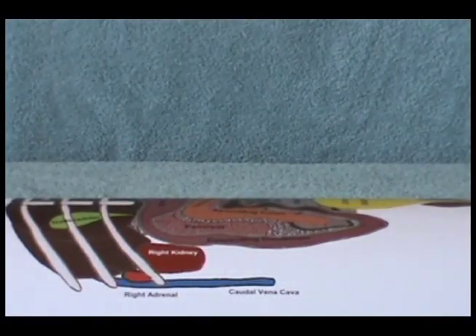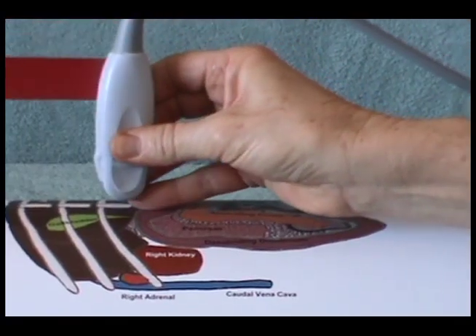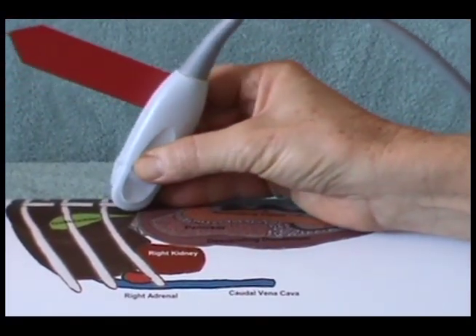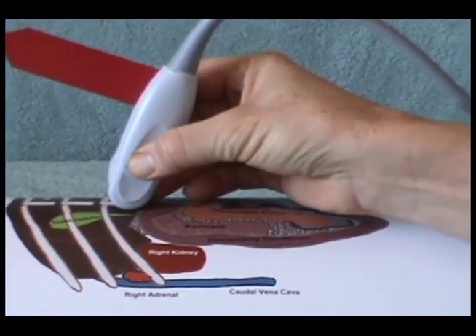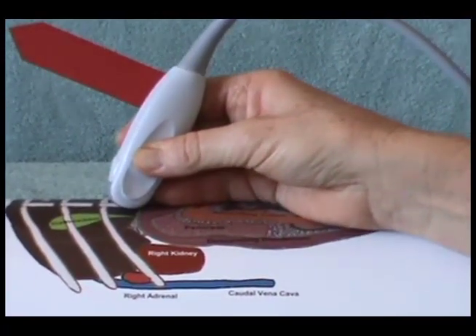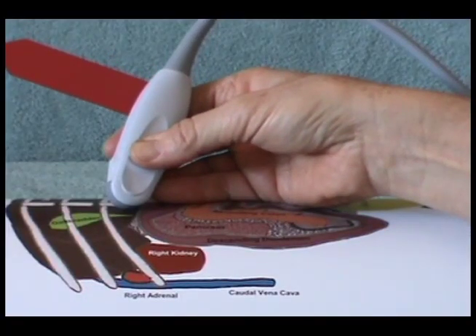Place the transducer in a sagittal position at the patient's right side of the xiphoid on the abdominal graphic and angle cranially. Anchor your transducer hand to the abdominal graphic. Fan the transducer slowly to the patient's right side till the transducer is pointing toward the gallbladder.